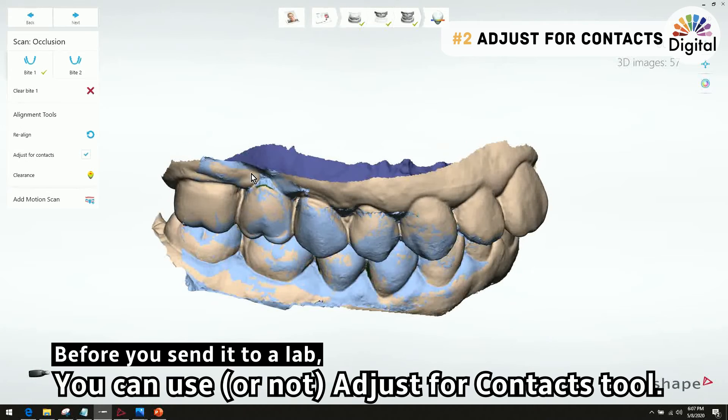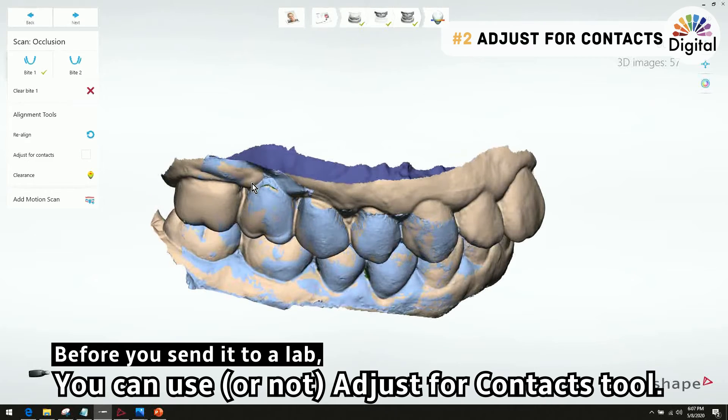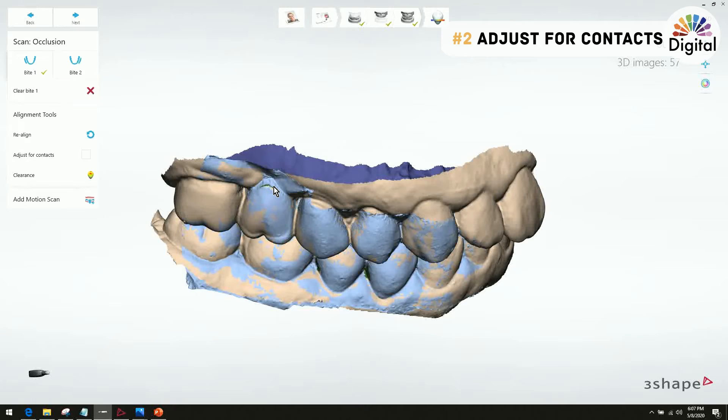Please make sure we have enough bite scan data. Before we send to the lab, we want to make sure whether to use this function or not — you can check both, turn it on or off. Let me show you a color map comparison with it turned on and off a little later. Now let's go to the third tip.